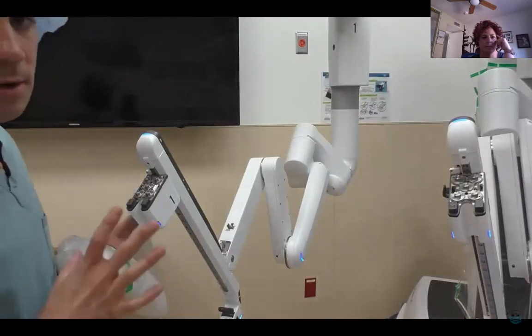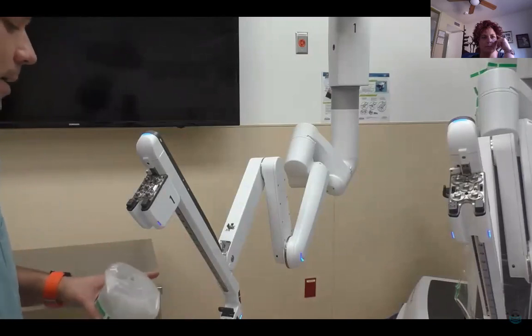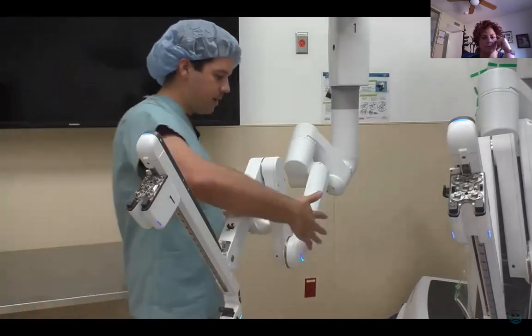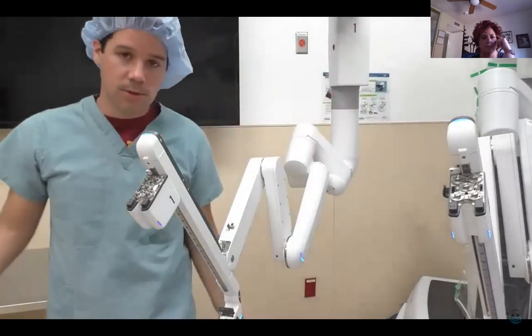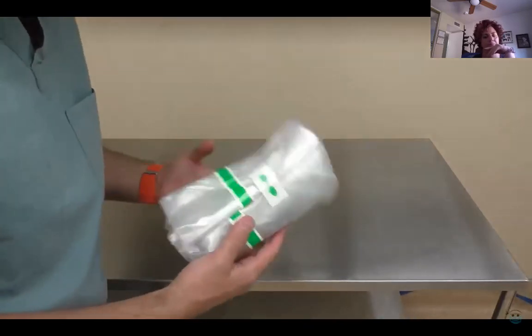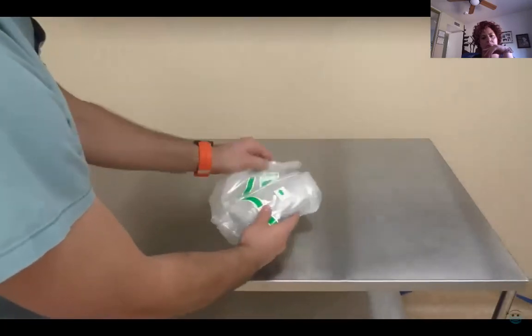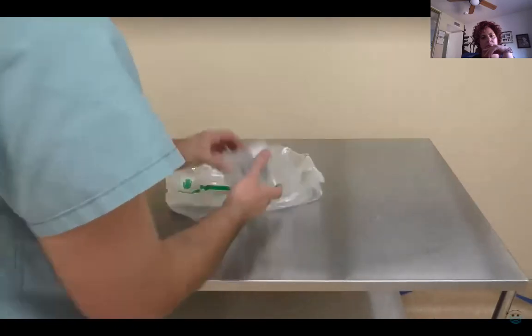It's much easier on this console, or on this robot, than it was on the SI. You're basically going to start over this arm and move up, move up, move up, until you get to the magnets, and just put the magnets in place. This is the arm drape as you're going to get it right out of the package on your field. So it's on your sterile field. Pop this tape open and fold it out.